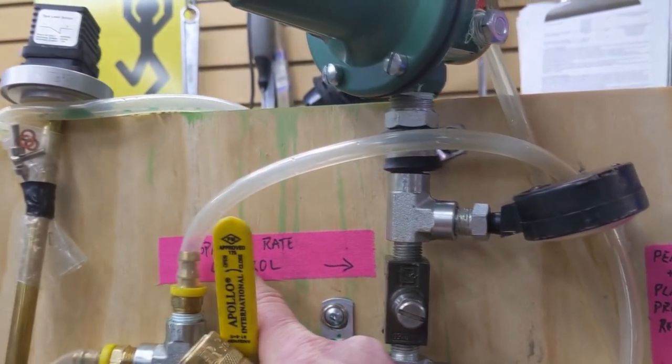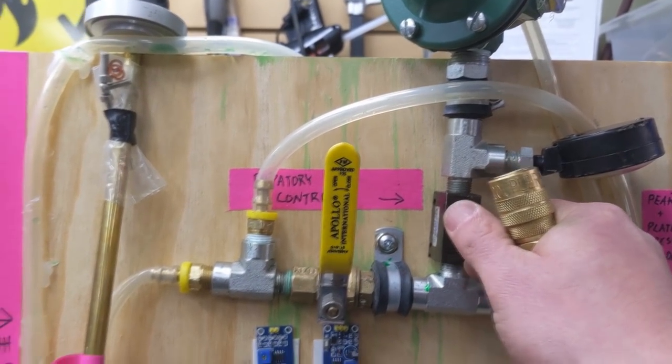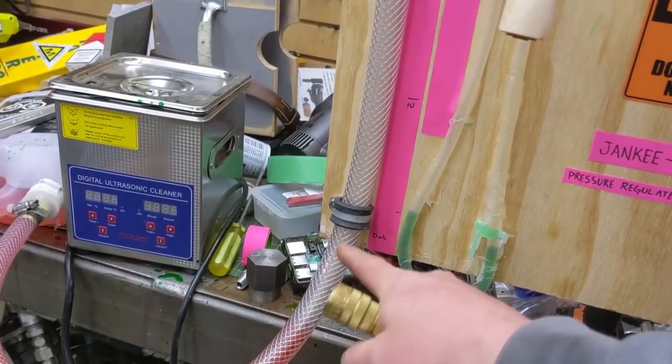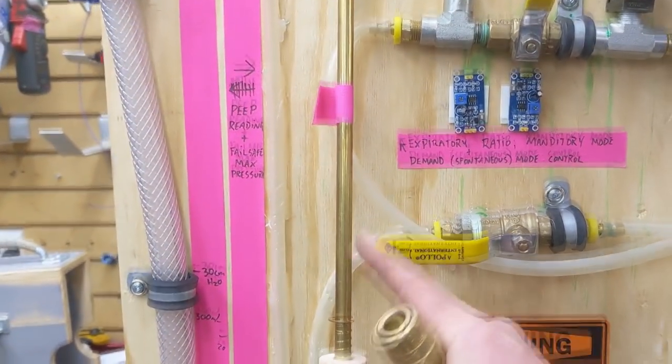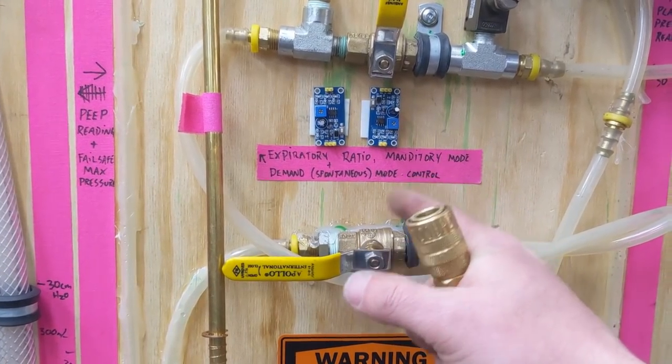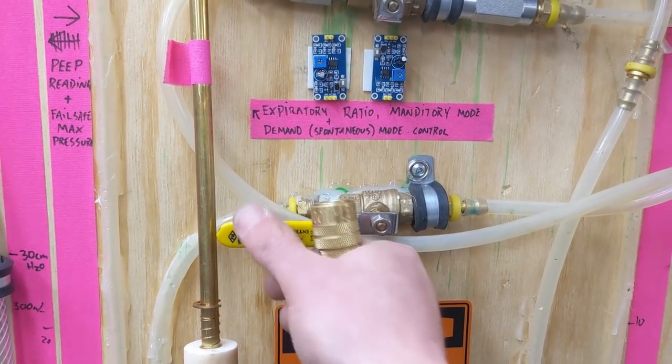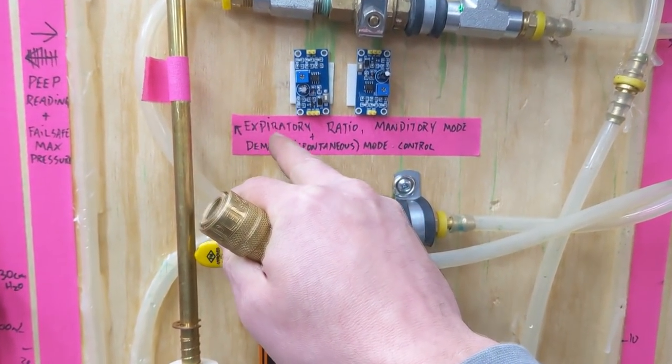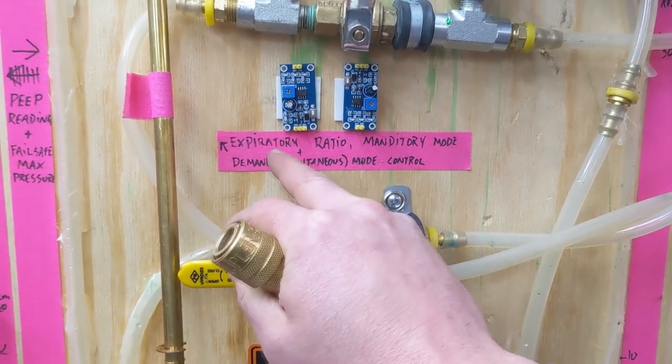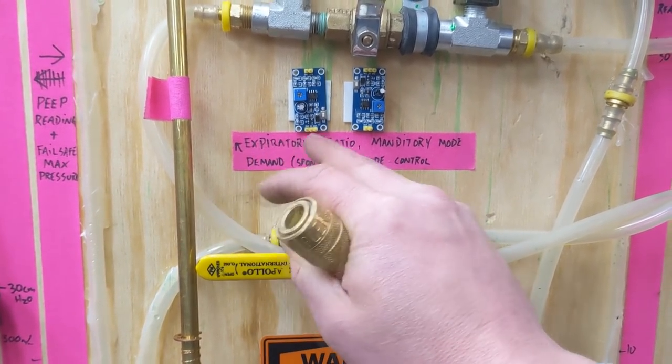This is the respiration rate control. This is just a needle valve. And what that does is it fills that bladder up, which brings this guy up, which triggers the float switch, which triggers the 555 timer, which fires the solenoids. And what we can do is these triple nickels control the ER. That is, you're supposed to exhale for longer than you inhale. So we can set all that up. The requirement, according to the UK document there, was between one to one and one to three. And we can do that.